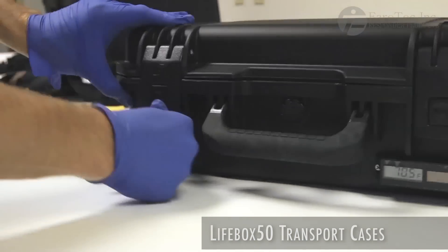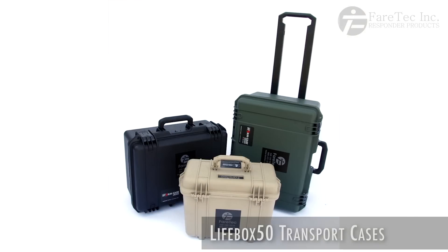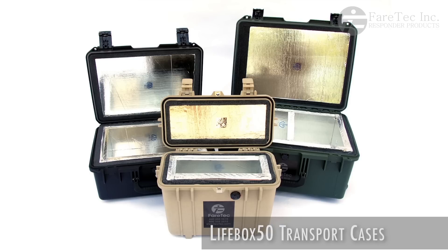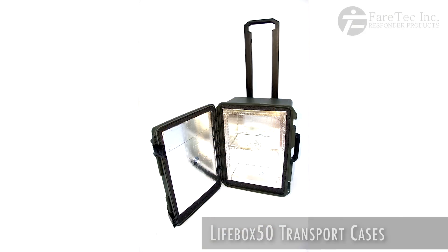The insulation panels are easily removable and can be cleaned or even replaced if necessary. The Lifebox 50 is available in several sizes, ranging from small personalized units up to large wheeled containers.